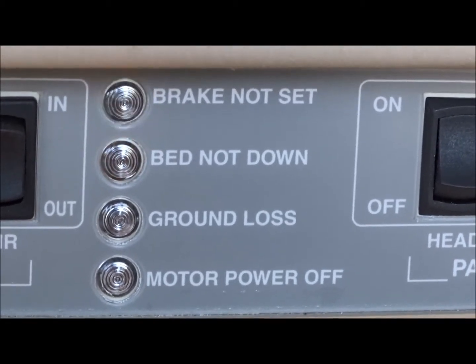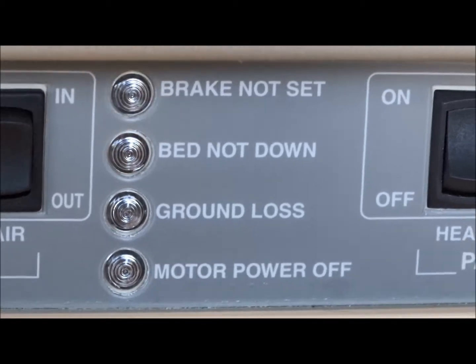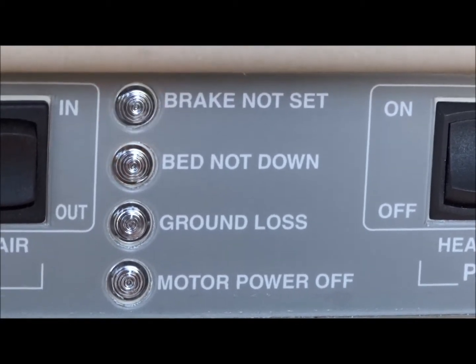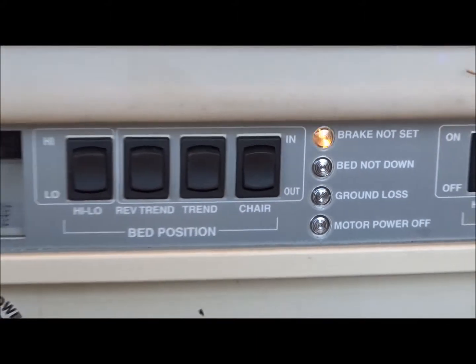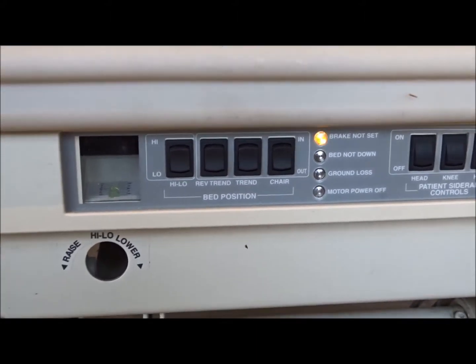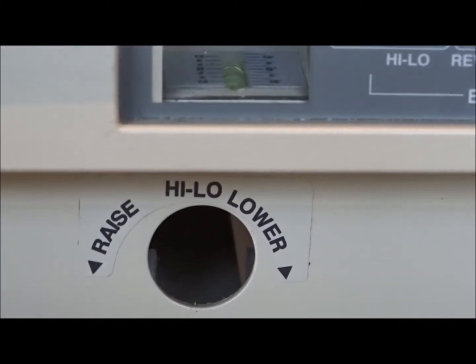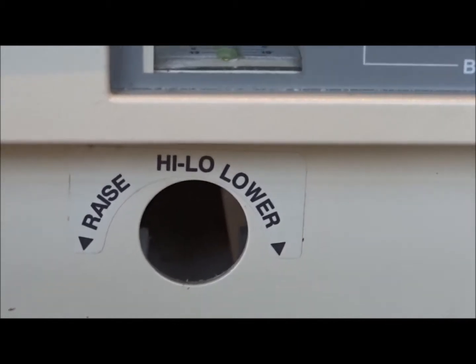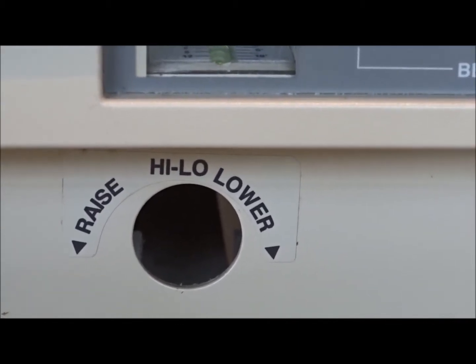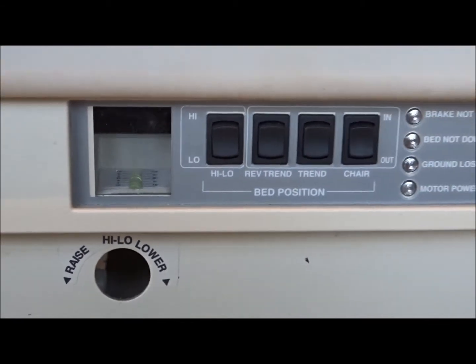You also have blinking lights so you know when the motors are turned off — for example, if ground is lost or the plug is not firmly connected. The bed being not fully lowered is also indicated, since it's not ideal to get out of bed unless it's all the way down. Additionally, all beds have a crank section. If you ever lose power, an IV pole has a special connection on the end and you can crank the bed to adjust the settings manually.